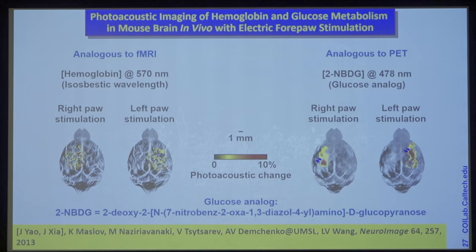And so you can see the power of this technique. Not only do we provide multi-scale imaging, but we can also connect with MRI, we can connect with PET, we can even probably connect with ultrasound imaging. So this is very much like a common string that allows you to connect all the different techniques to provide a comprehensive study of the problem you're researching.